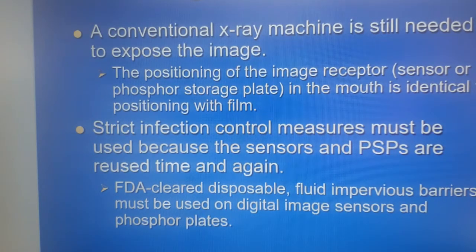With indirect imaging, we have thin flexible plates that contain phosphor crystals, similar to our X-ray images, and from there we create a latent image. This latent image then requires us to expose it in a scanner, which processes this technology into an image, and thereafter we have to make use of a light box to clear our plates of the image that we had just taken beforehand. Both of them, ladies and gentlemen, digital as well as film, strict infection control procedures must be adhered to.